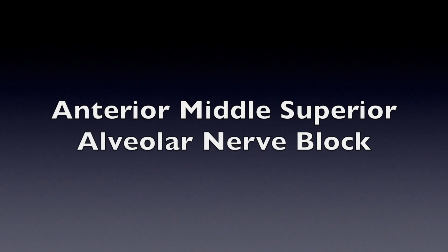Technique options for palatal anesthesia. The gate control theory suggests a two-stage technique is helpful for pain management. One option is pressure anesthesia used for 1 minute following 1 minute of topical application. The clinician should maintain pressure near the injection site until penetration of the needle and initial blanching.